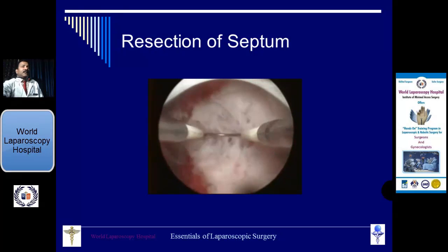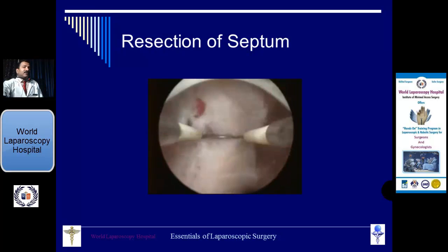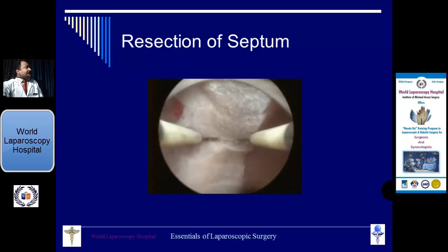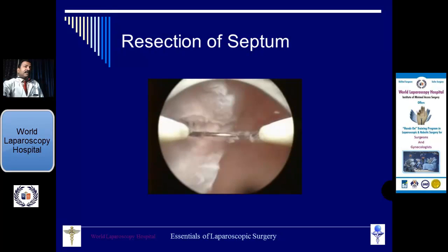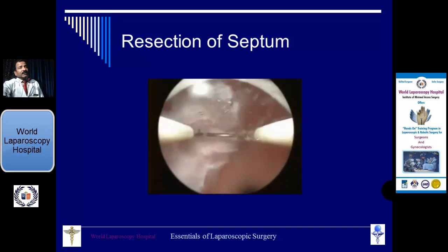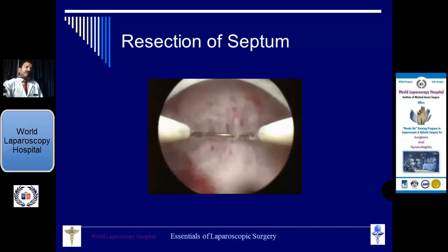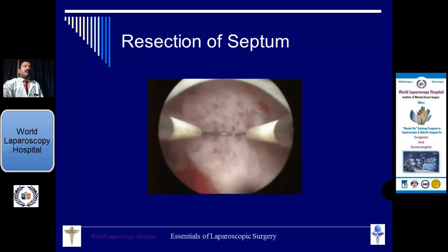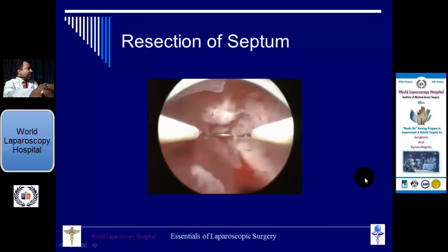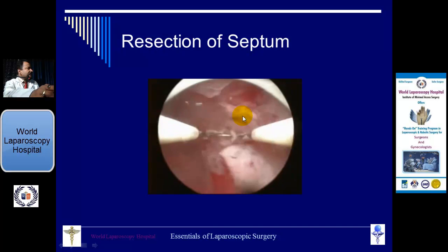And laparoscopically, how are you confirmed? There was a whitish band in the middle of the uterus, and now it is splitting, and now you can see the brightness of the surrounding coming nearer to the tissue. That means it is now approaching, and that means you have to be slow. So that way it is easy for the texture gradient to help you while you are doing the operative hysteroscopy. And now it is over, because it is now equal to the other, and it is done.